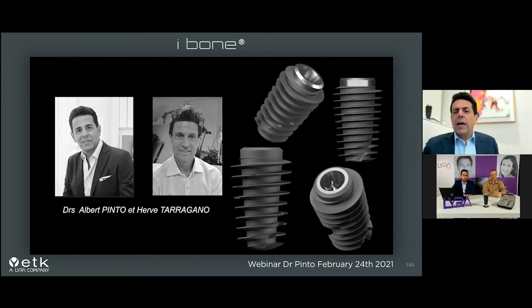There is a big problem with the technique of the Megagen implant. For the Straumann, I don't know Straumann well enough, but only from seeing the catalog, I can tell you that the problem is the diameter, because it's not the same philosophy. The philosophy of this implant is to keep the core as thin as you can, and work only with the horizontal aspect with the thread. And in the Straumann, the body gets very, very large. It's totally different. Yes, exactly.